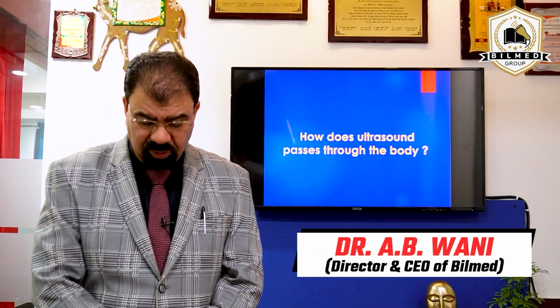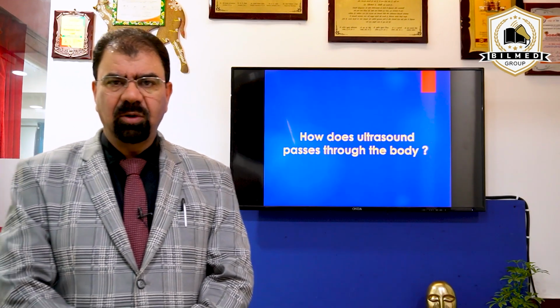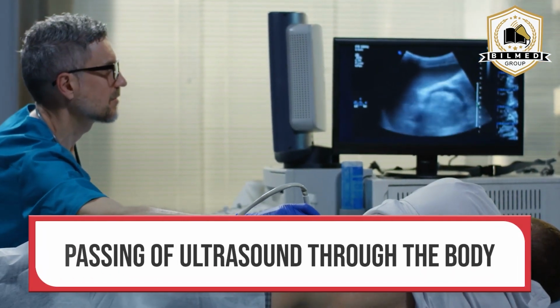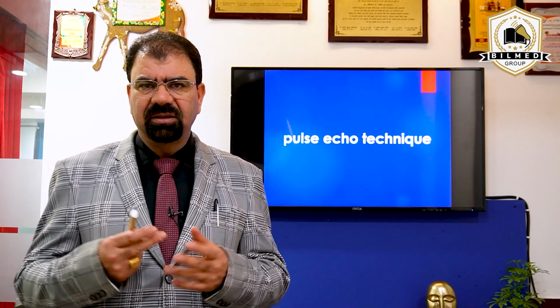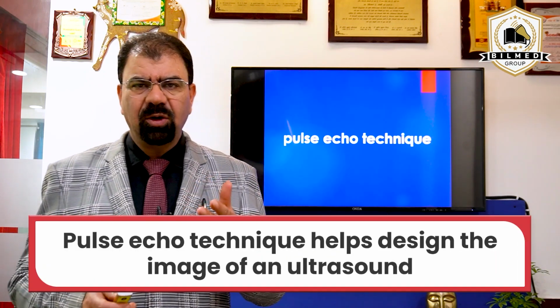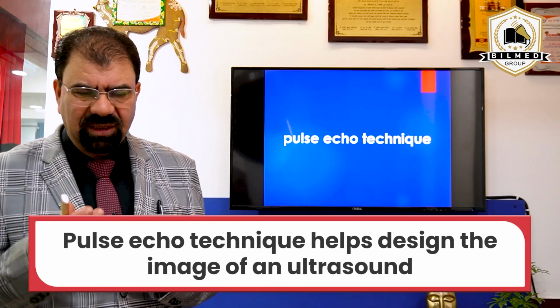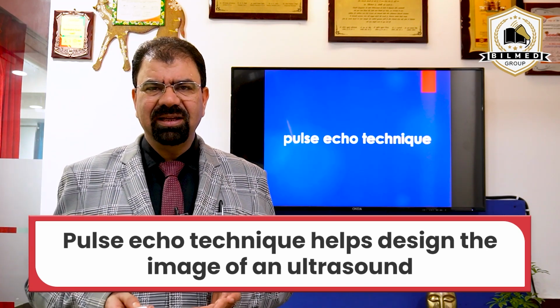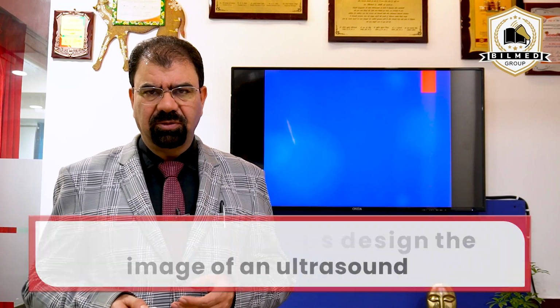Ultrasound Training Institute. Today we will discuss ultrasound, how it passes through the body. Now there is a technique which is called the pulse echo technique. By this pulse echo technique, we are able to generate an image of ultrasound.